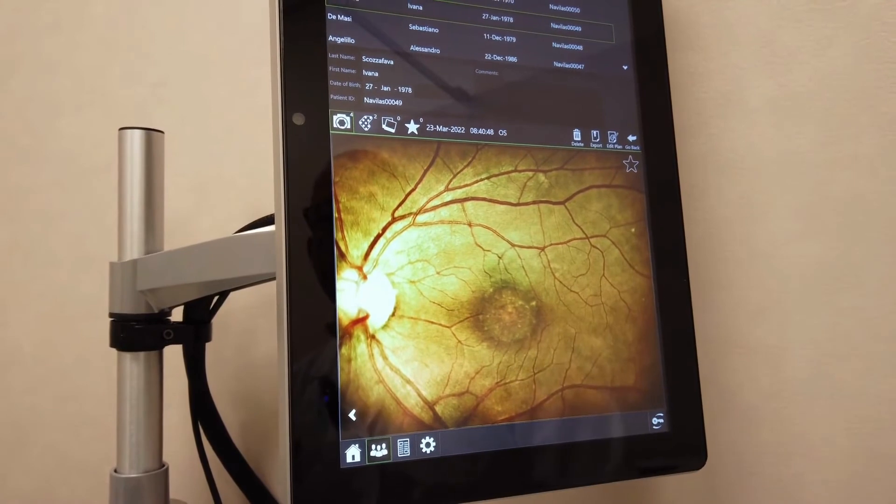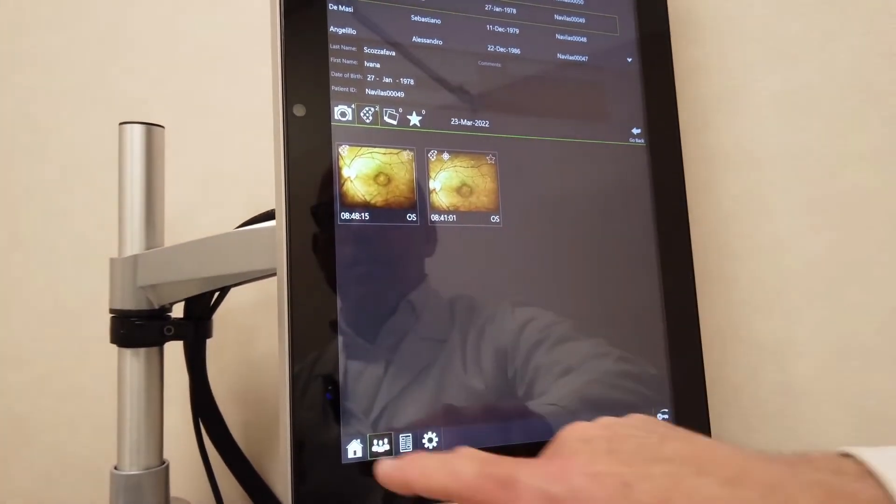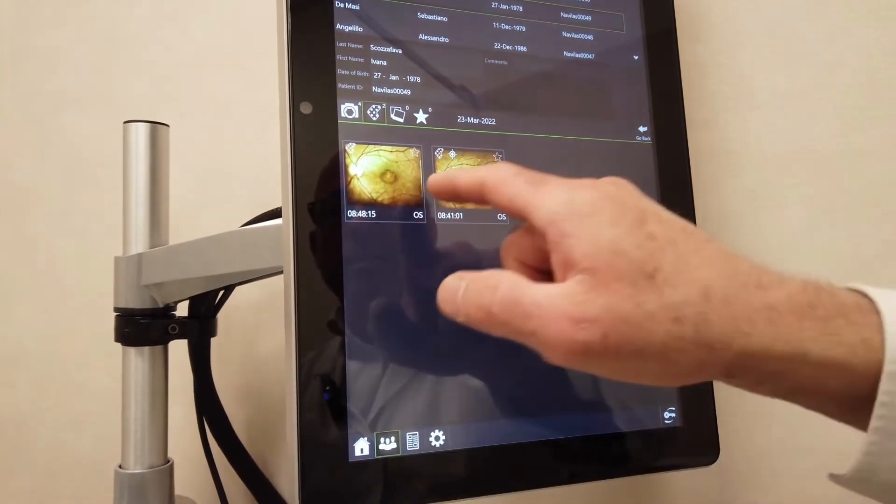The patterns, of course, are different — you have to choose a different spot spacing. So a treatment closer to a traditional treatment.